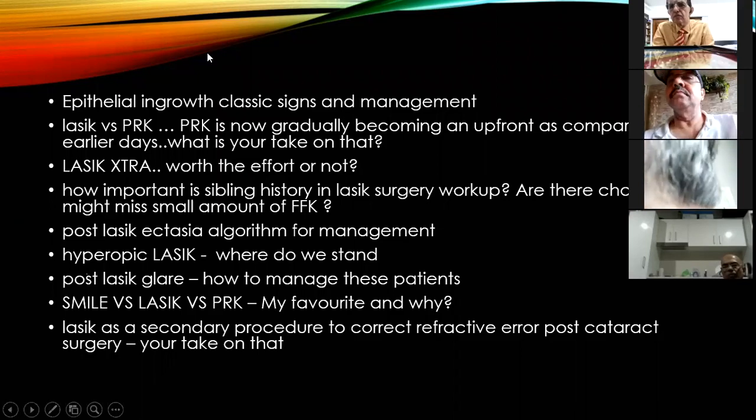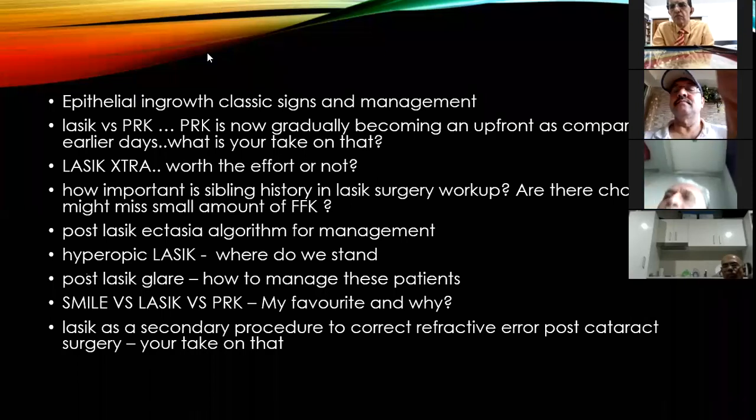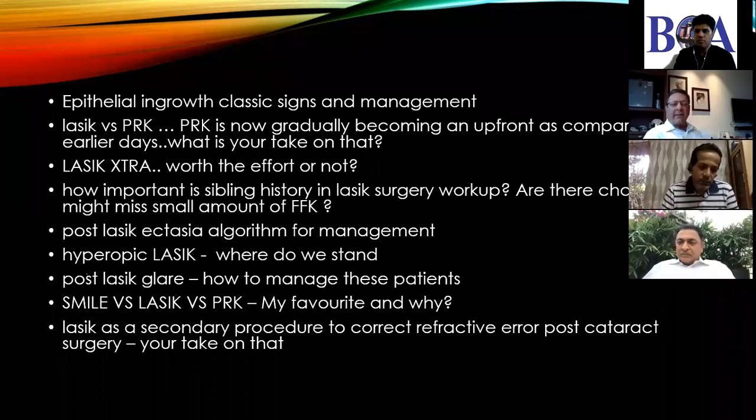No, personally speaking, I have no problem with lifting the flap at all, at any point in time post-surgery, even years later. My technique is such that I always run my spatula under the flap as a final round around the boundary to see that there are no tags that have gone in or inverted into the stroma.